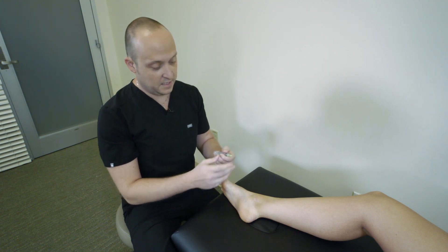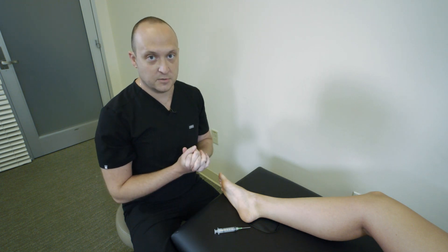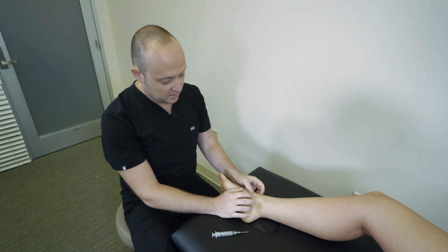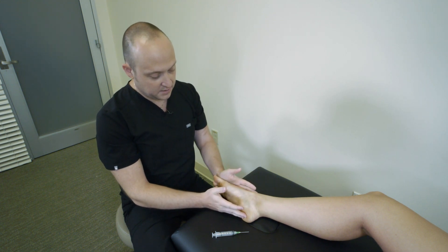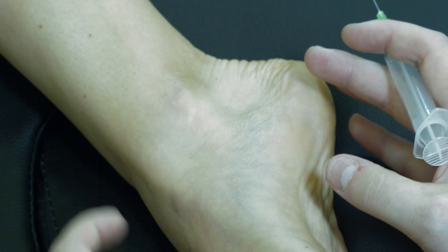For demonstrations, we're using a blunted 21 gauge needle, but you'll go through your typical setup and standard precautions to appropriately address the patient's concerns. Our patient is in an externally rotated hip position with the foot in as much plantar flexion as we can get, which opens up the space between the tibia and the talus so we can see our landmarks pretty easily.